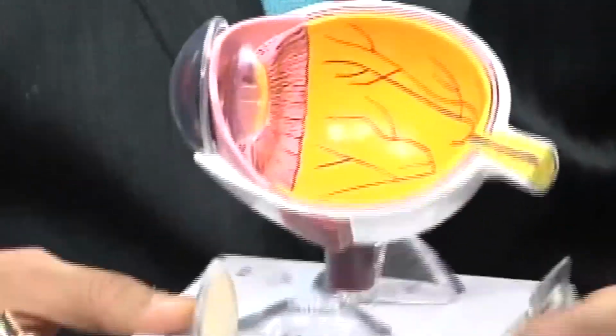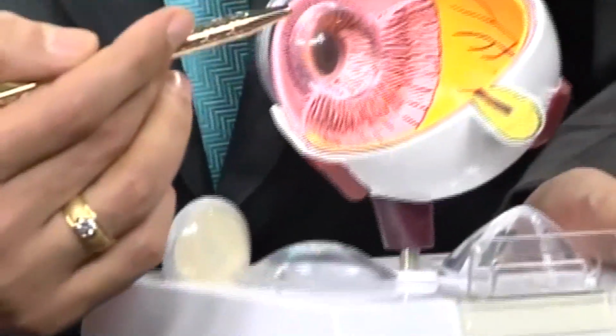Well, you know what, actually let's go ahead and show people here. You have a model of the eye. Absolutely. Let's bring this into the fold so people can see what you're talking about. If you look at this eye here, you can see that the eye is basically like a camera. And here's your cornea, or the front part of the eye, which is where LASIK works, and it shapes this cornea so you can see.